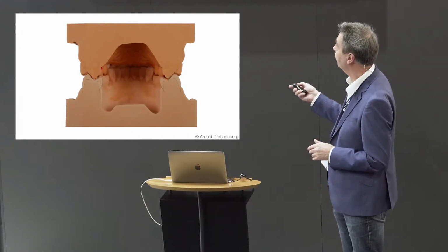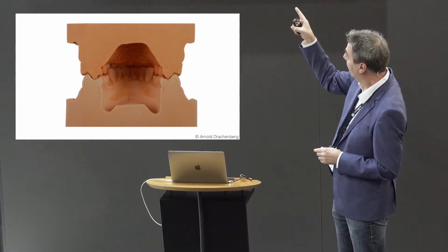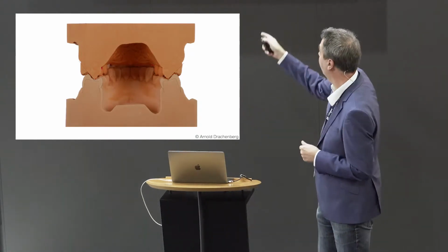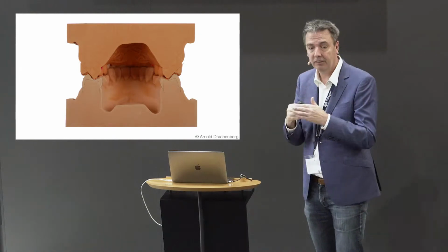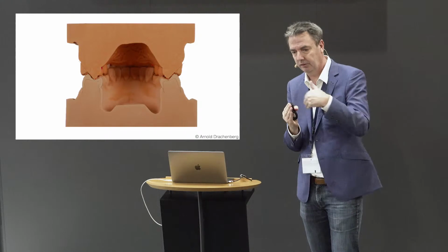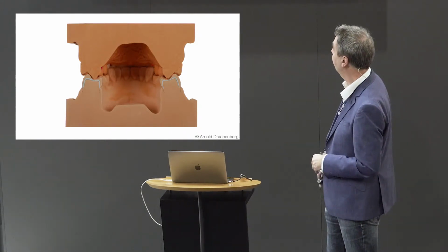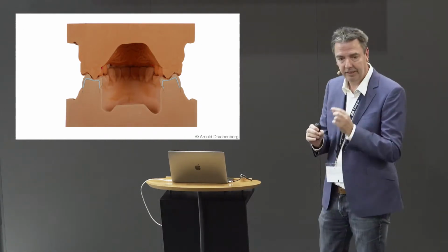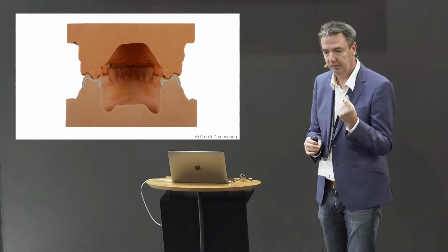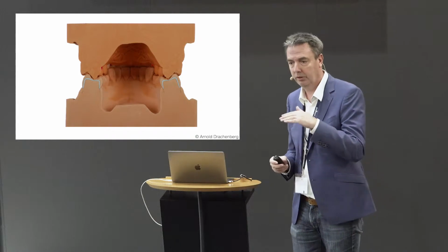Because, as you can see here, the tip from the upper first molar goes directly into this area, and there is not enough space. When the patient starts to move to the left-hand side and to the right-hand side, there's not enough space. So, if this is the coping, there's just the place for the coping, but we don't have any place for the ceramic, for the layering. So we have to do definitely more reduction.